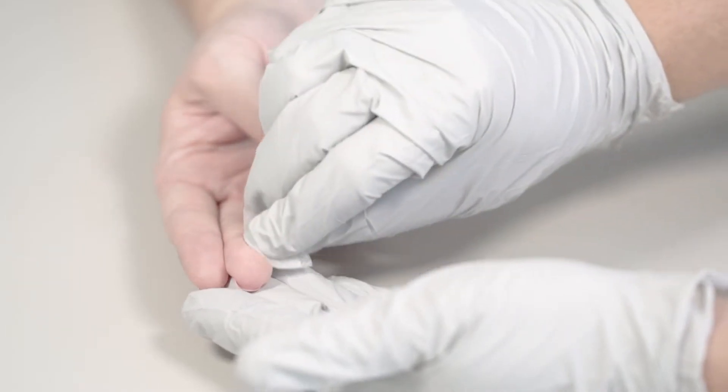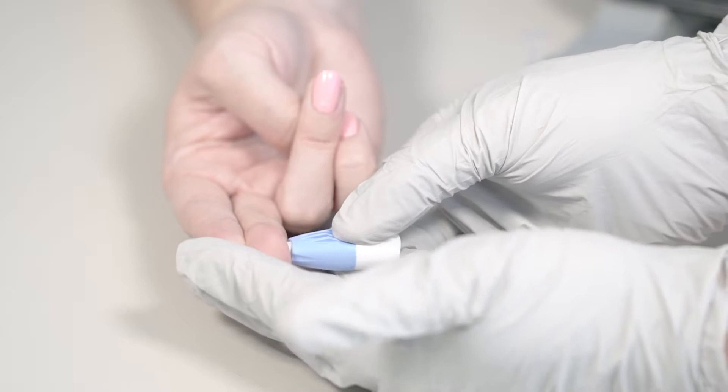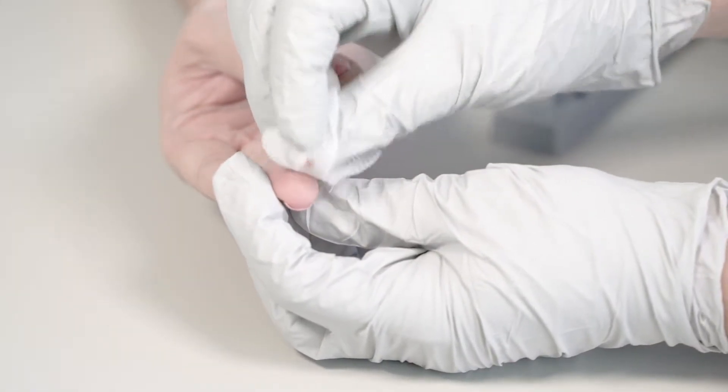Start with sample collection. Use the alcohol wipe to clean the patient's finger. Use the lancet to prick the finger of the patient. Wipe away the first drop of blood with the clean gauze.